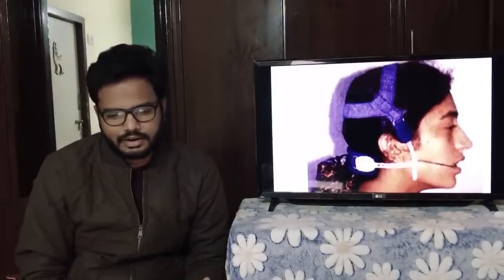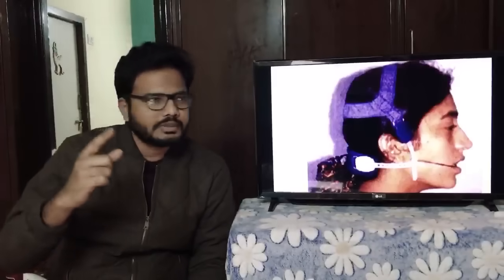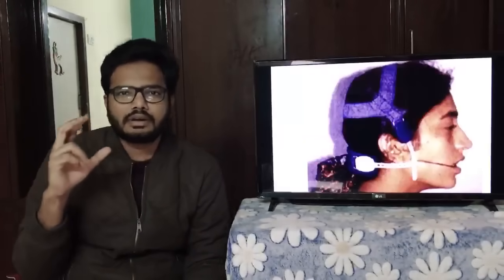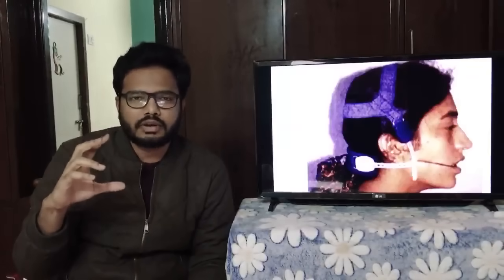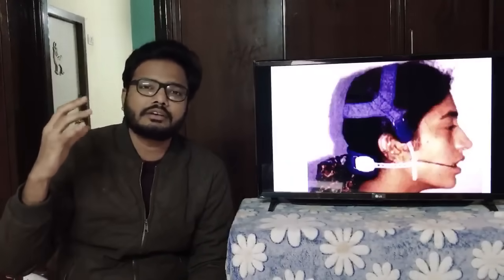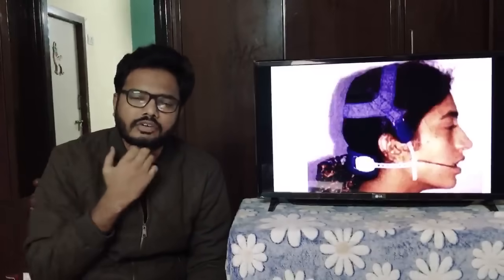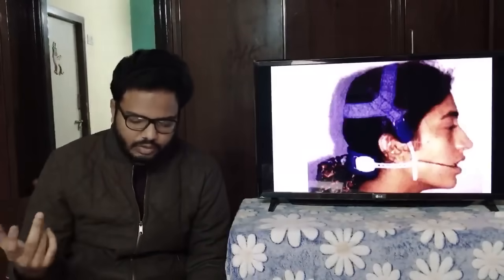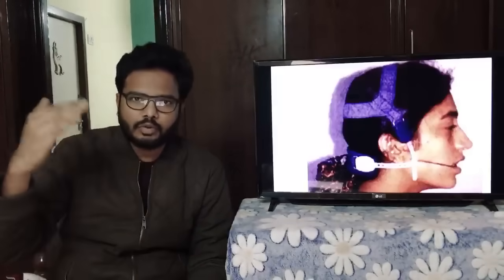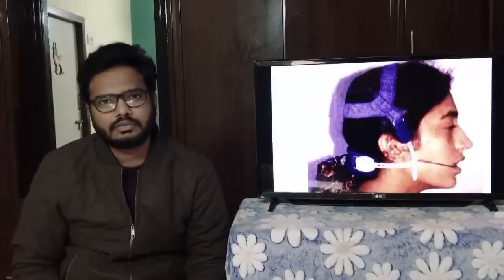You can see, yes, Daivika seems to be having the right answer. Cervical and occipital. So it's a combination kind of headgear. When the forces from cervical and occipital are equal, then there will be distal and slight upward movement or force created on maxilla. Depending upon varying the force content in cervical and occipital, we can alter the direction or the magnitude of force, right? So desired force direction can be achieved. So it's a combination of occipital and cervical headgears, right? When the forces from these two types are equal, then there is slight upward and distal force acting on maxillary teeth as well as on maxilla.